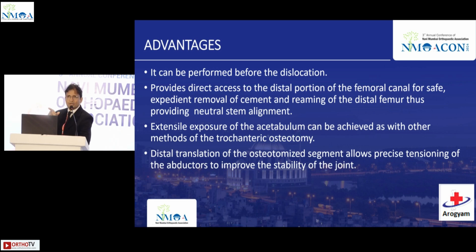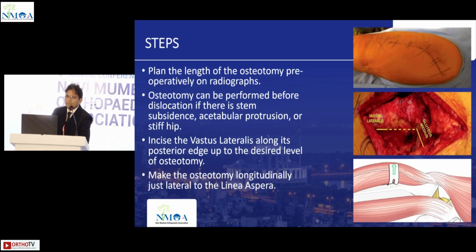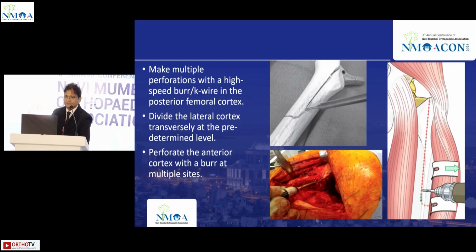In the diaphysis, you can put the reamers after doing the osteotomy, and you can centralize your revision stem. So these are the steps for doing an extended trochanteric osteotomy. I prefer a posterior approach. After doing the approach, you retract the vastus lateralis, delineate the osteotomy site with maybe a marker, and then put in small K-wires or burrs to delineate the osteotomy site. It should be around 7 to 14 centimeters.